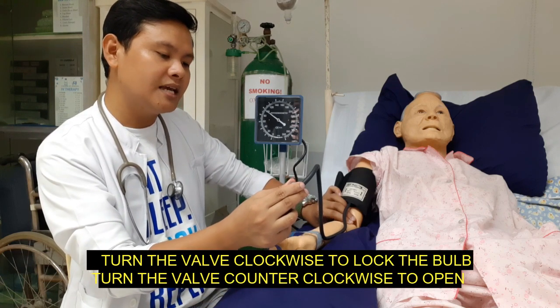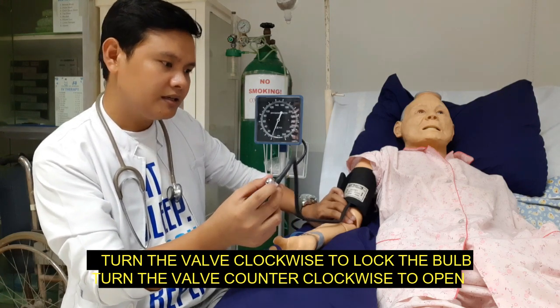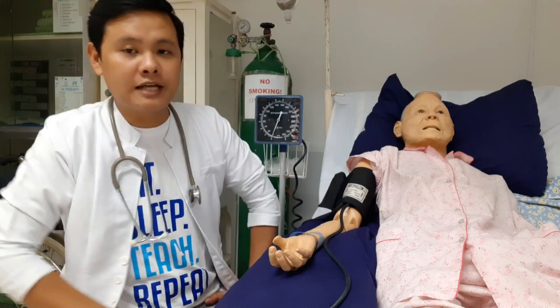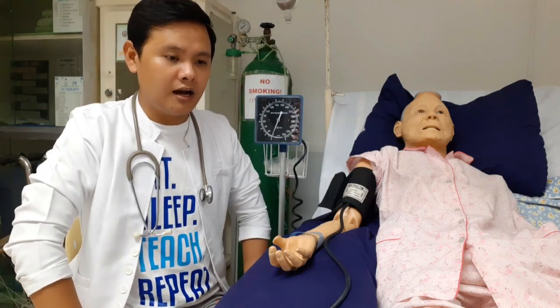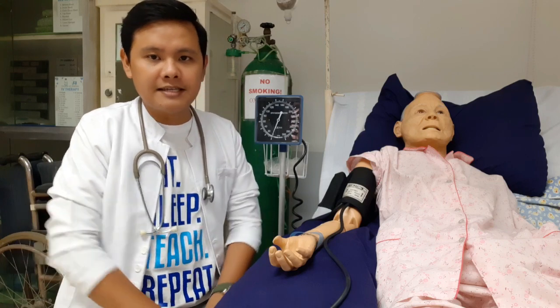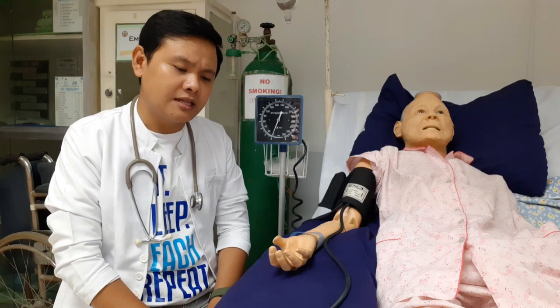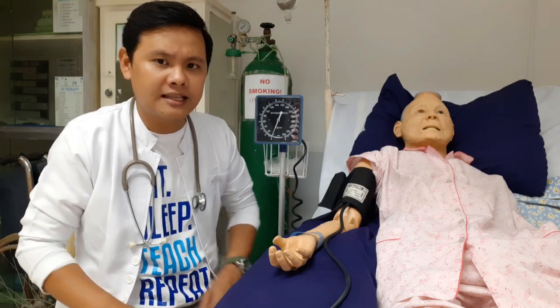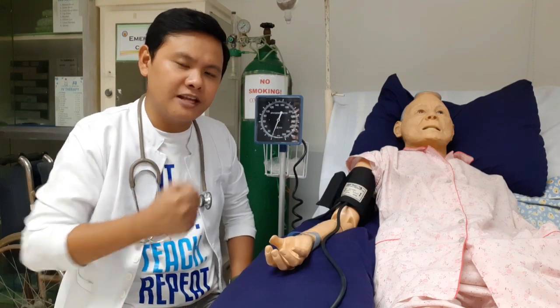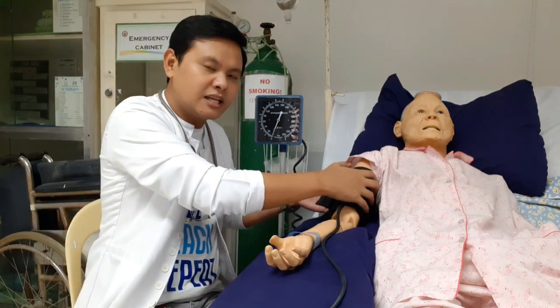So, dahan-dahanin natin bitawan, counterclockwise. I-unlock natin yung bulb. Okay? So now, na-locate na po natin kung nasaan yung systolic pressure ng pasyente natin. So in that case, we will now position the stethoscope appropriately. So hintayin natin about 2 minutes bago natin kuhanan ng BP or bago natin inflate yung cuff natin. At least 2 minutes. Bakit? Kasi naglagay tayo rito ng pressure.